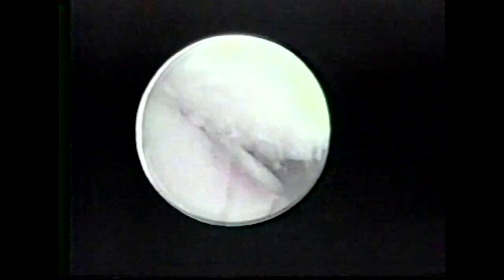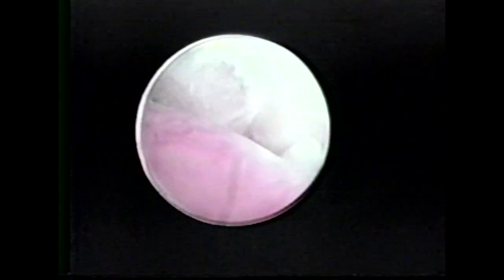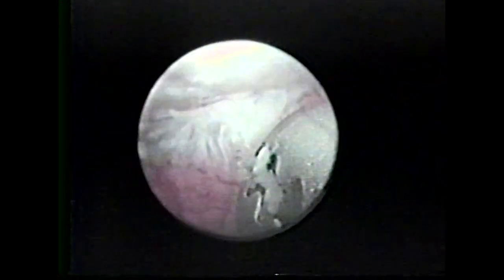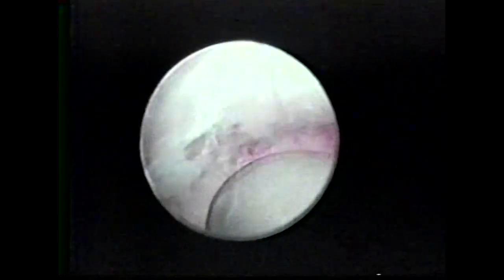Here we can see a small cartilaginous fragment being pressed between the articular surface of the eminence and disc. A grasper forceps is utilized to retrieve the small fragment from the articular surfaces.